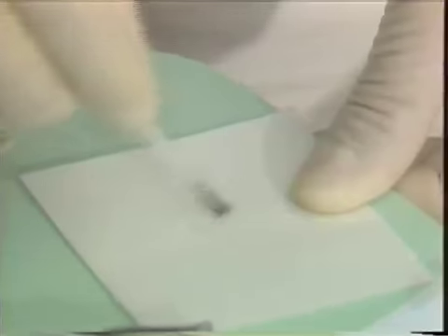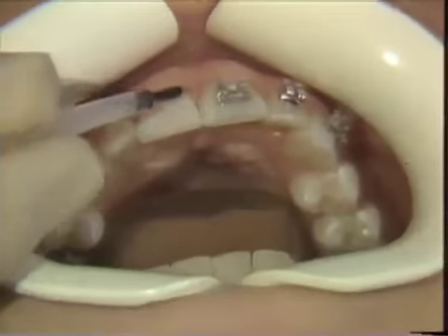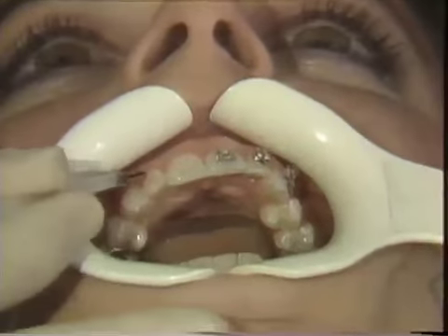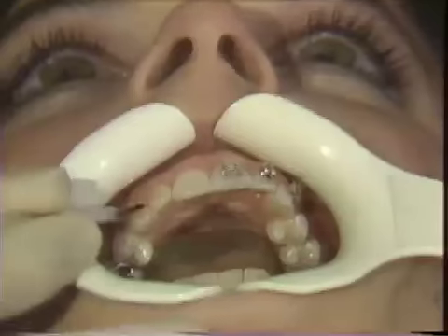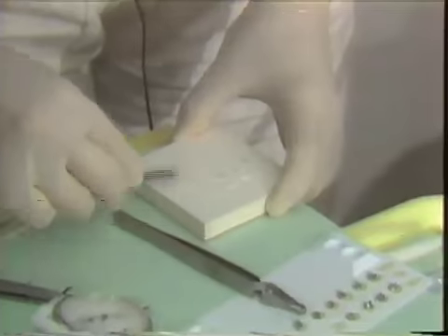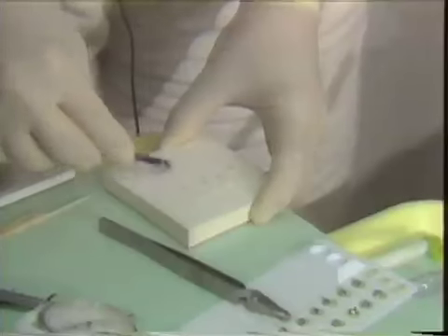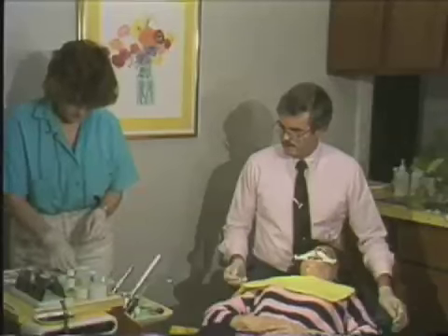Because the sealant is a liquid, you mix parts A and B together quickly in just a few seconds. Then the sealant is applied to the labial surface of the teeth, again starting in the gingival area, making sure that you do not contact the gingiva. Okay, and then there should be a uniform, shiny appearance to the teeth. Now the two parts of the Phase 2 are being mixed together, and then a small amount will be placed on the bracket. There's an individual mix made for each bracket that is being placed.